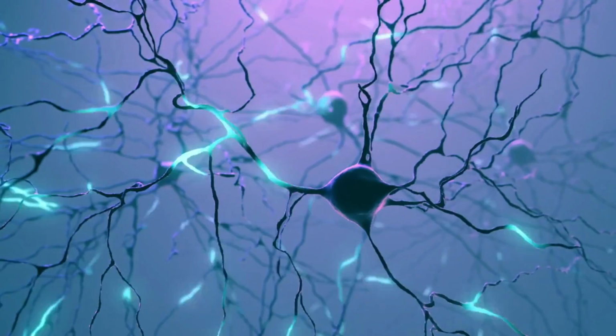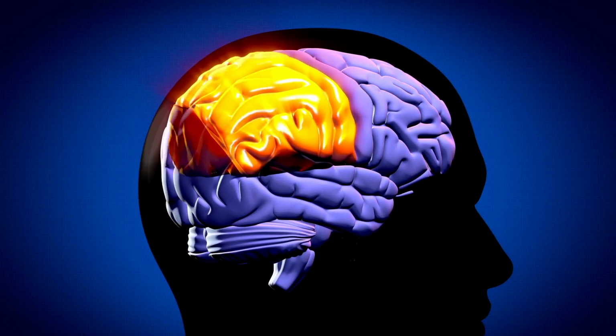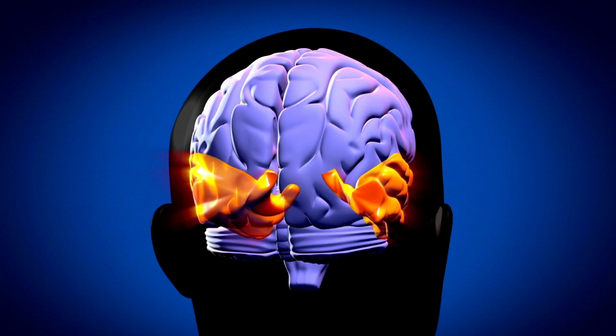Information is got back maybe 24 hours after that, maybe sooner. Then they look at what the map shows. So 400 pages of data of what's happening at 1 hertz at each of these locations using the International 10-20 system, 2 hertz, 3 hertz, 4 hertz, all the way up to like 40. Also, how the brain is communicating with itself. So they look at absolute power, relative power, power ratio, asymmetry, coherence, phase, alpha peak frequency. Look at all of that and compare it to the statistical norm.